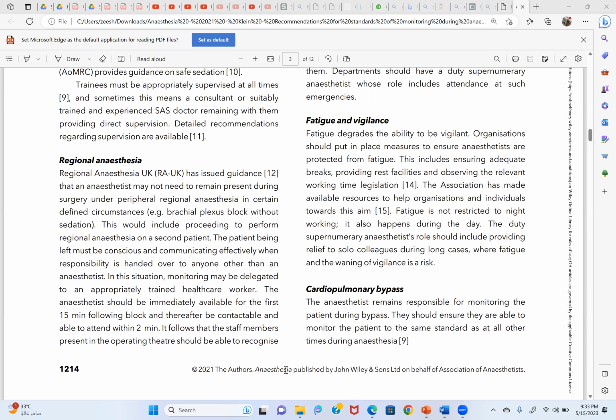Okay, actually, if for example, the patient has become apneic, you have put a sheet on the patient, and you don't know. If you have an end-tidal CO2 monitor, it will immediately tell you that the patient has become apneic. Or even if the patient is gradually not breathing well, you will get to know. The pulse oximeter will lag behind because the saturation will come down late. So that's why end-tidal CO2 monitoring is very important.